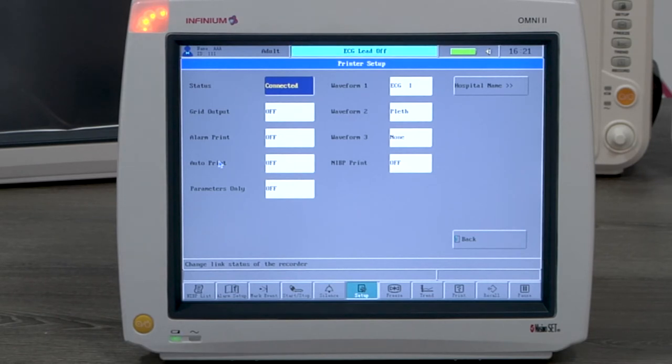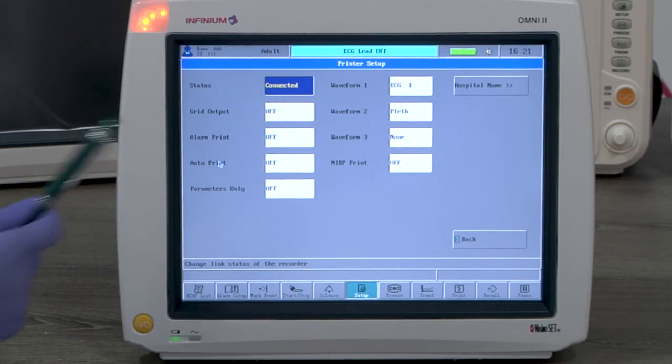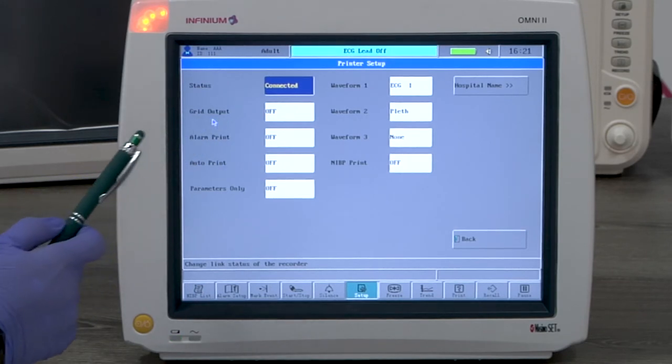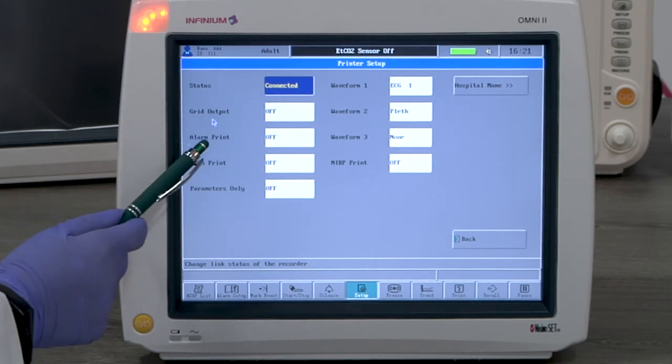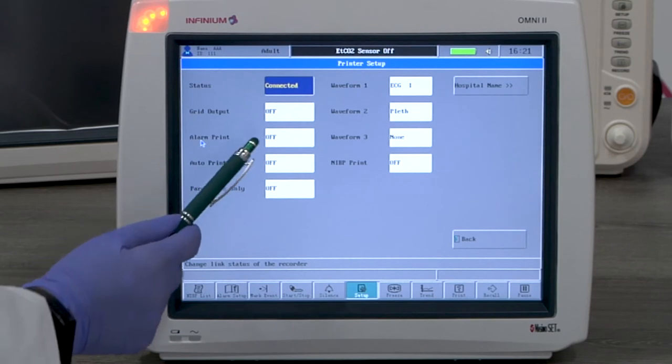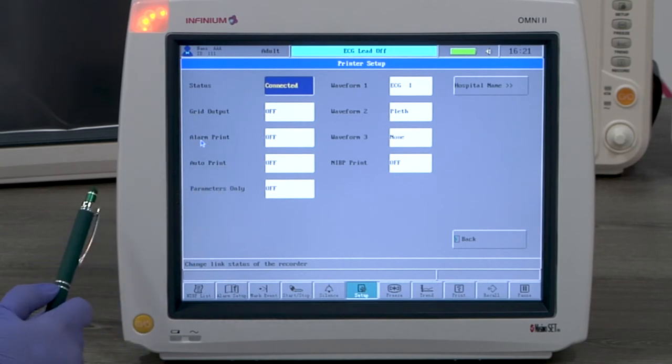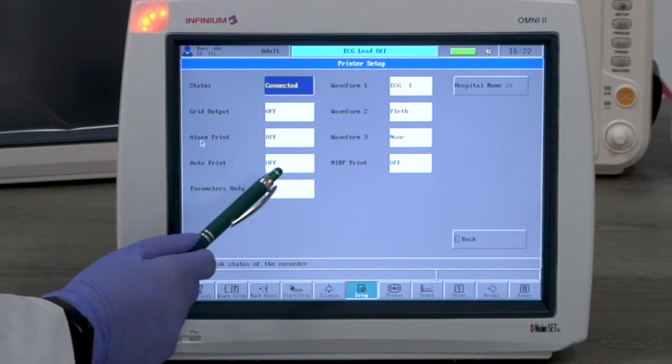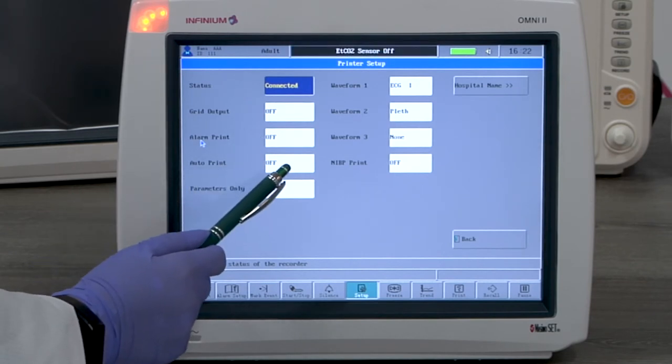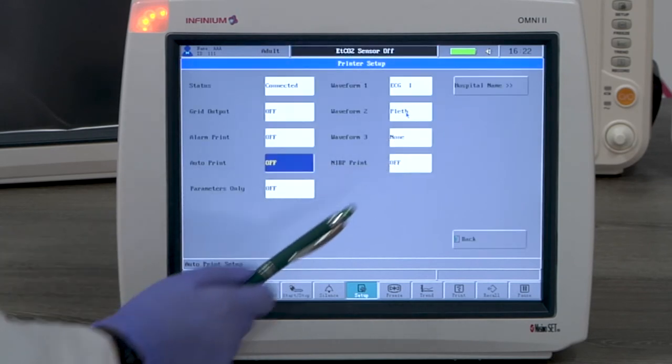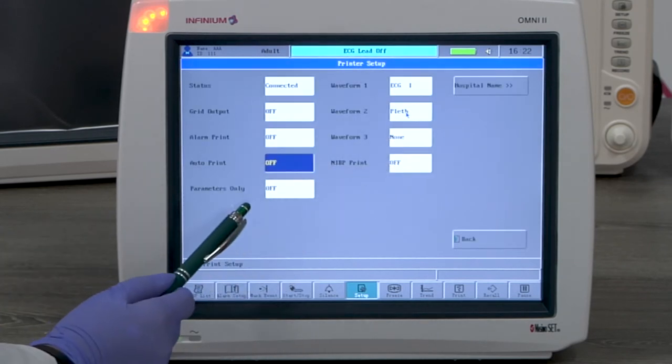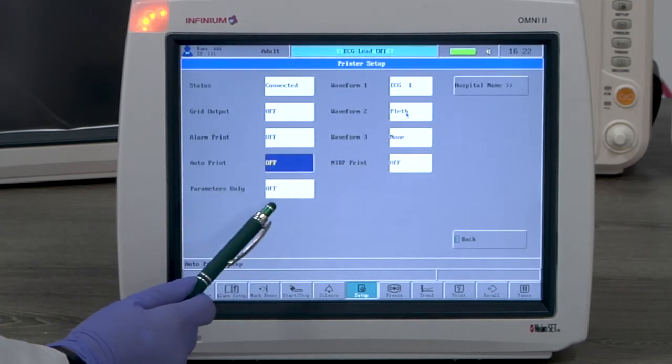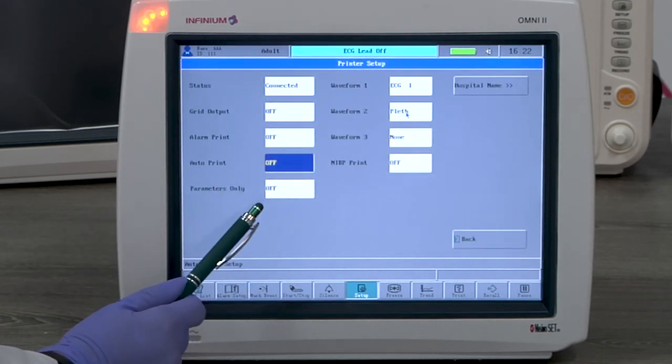Grid output, if on, puts a grid on the printed paper. Alarm print, if on, prints automatically when there is an alarm. Auto print prints automatically based on the set interval. Parameter only, if on, prints no waveform, only the parameter chart.